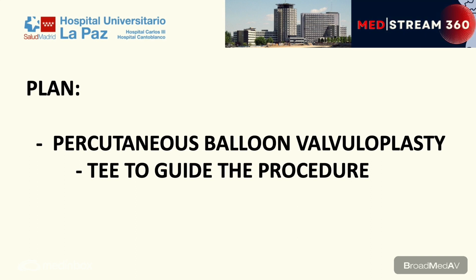As Clara said, we have a severe mitral stenosis, and now Silvia is going to explain to us the current situation of the echo. Hi, welcome everyone. I'm Silvia Balbuena, I'm the echocardiographist. So here, I think you can see my echo. Okay, so first thing you have to do, of course, before we come to the cath lab, is to appropriately select the case. So that's, I would say, the main role of the echo, if possible, of the transesophageal echo.